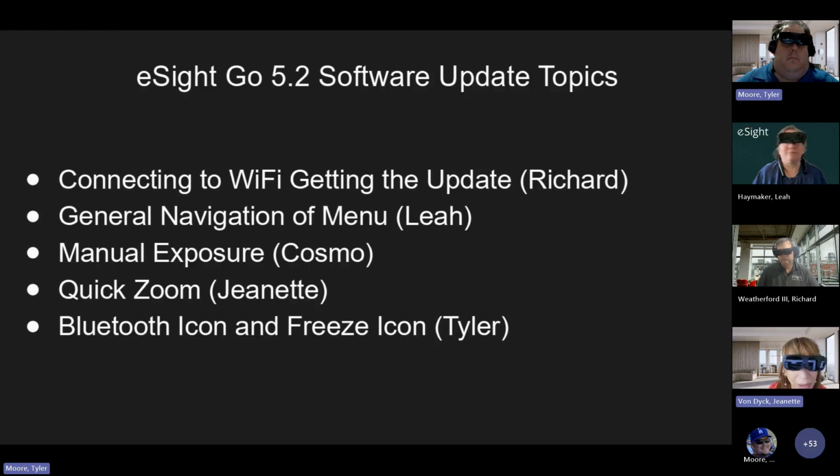So some people know that when I'm looking through my eSight and zoomed up, I tend to like 10 times zoom, or 15 times zoom, or 6 times zoom. And so I'm going to go into the settings menu. I'm going to go past brightness, and the next one down is going to be quick zoom. I'm going to go in there, select it with my mode button, and then it gives me the choice of between 2 and 24 times zoom, literally.